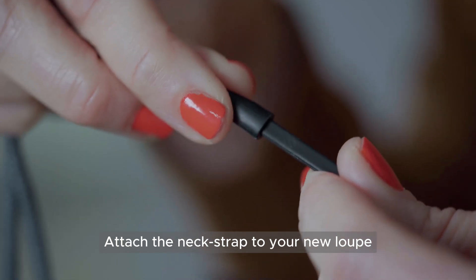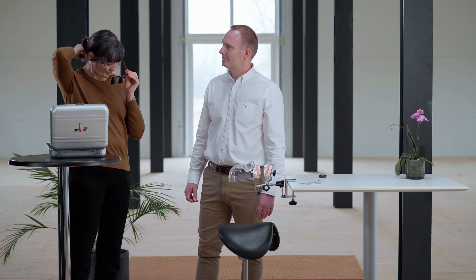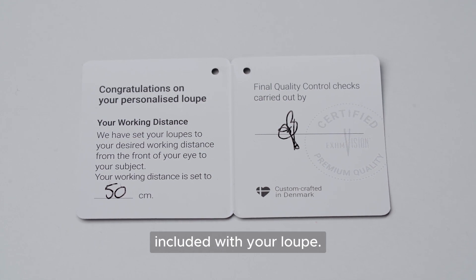Attach the neck strap to your new Loop and place it around your neck. Remind yourself of the working distance you ordered, which is written on the Quality Card included with your Loop.